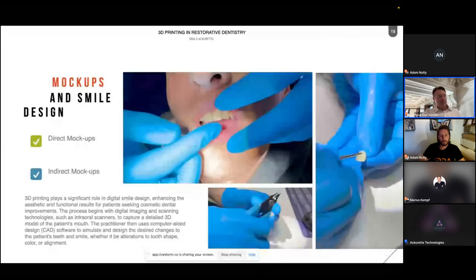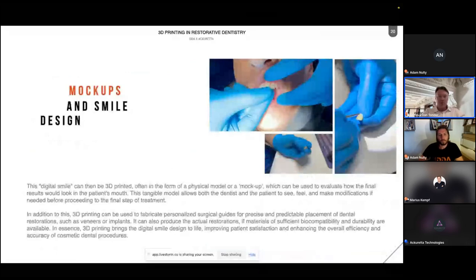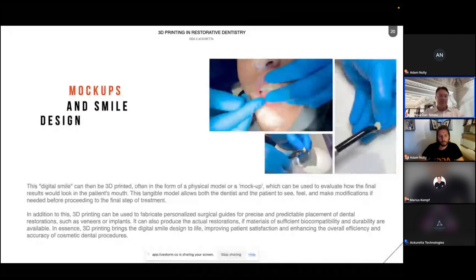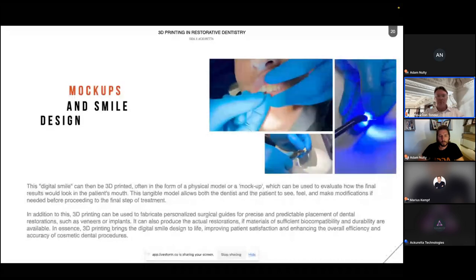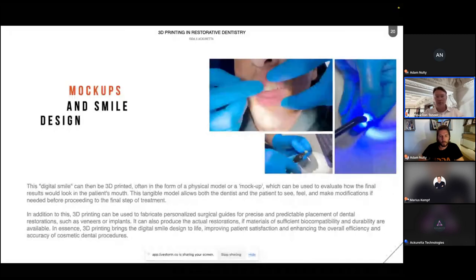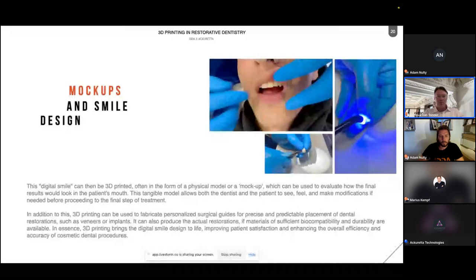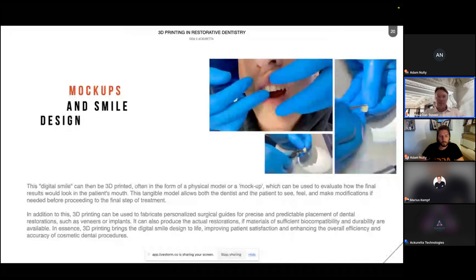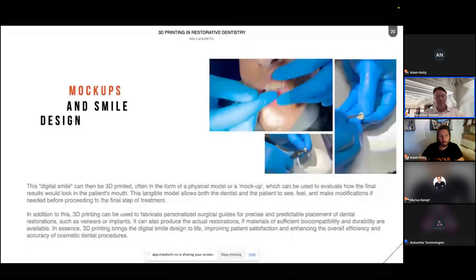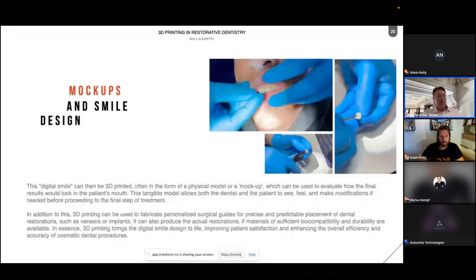The nicest thing about this, Adam, if you can go to the next slide, is that from a consent point of view, it's awesome, because what you show the patient is what you can then literally copy into their mouth. From a consent point of view, you have a very, very strong consent there. So the patient cannot ever come back and say, well, I didn't know what it was going to look like, I don't like it now, and things like that. For me personally, it's a really important part of my workflow, especially in the UK, for litigation and things like that. So it's invaluable in that sense, especially when it comes to your aesthetic work and when shapes of the teeth are important for your patient. So for me, that is awesome, and that is one of the biggest advantages of 3D printing.